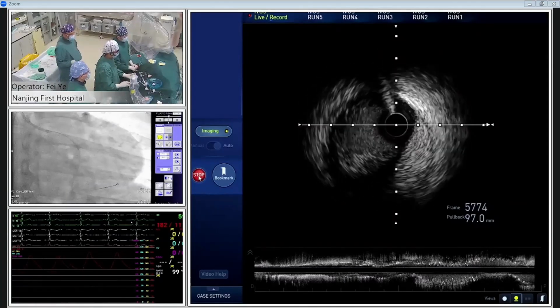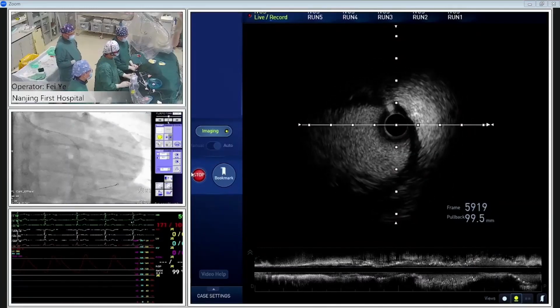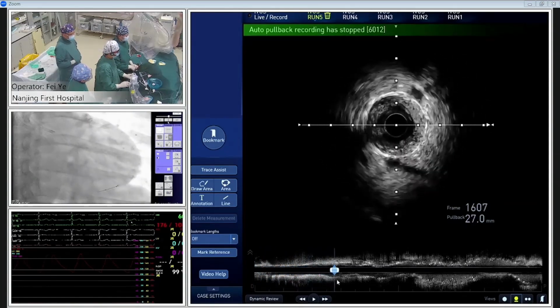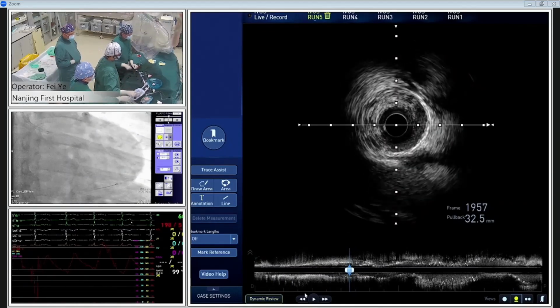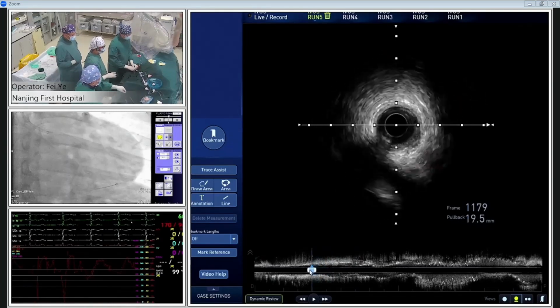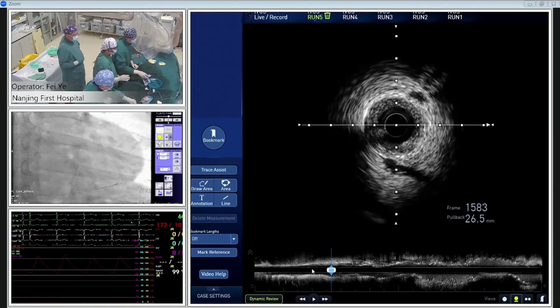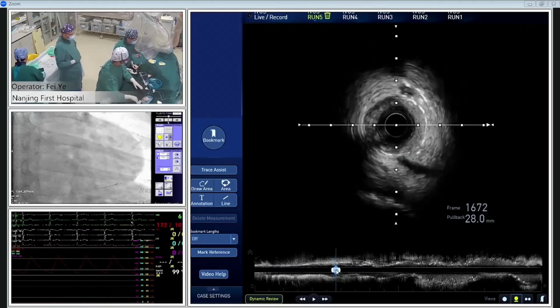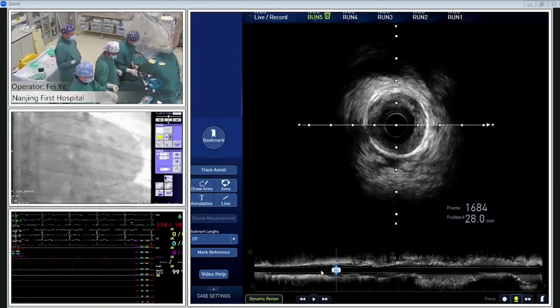Would you see any of the proximal part of the circumflex is good? It's a diffuse lesion. It's also okay. We can measure the distal part and the proximal part. At the stent edge, we can find the medial dissection. Yes, you can see it. And the hematoma. And wait, give me two balloon. Here, hematoma. Could you show me the distal part, the normal part?